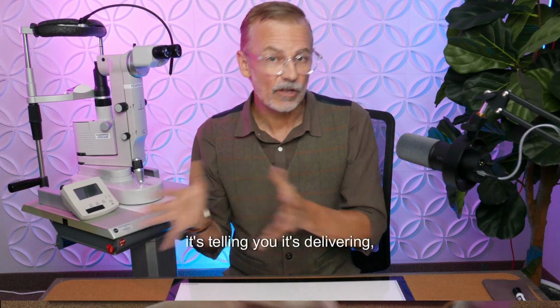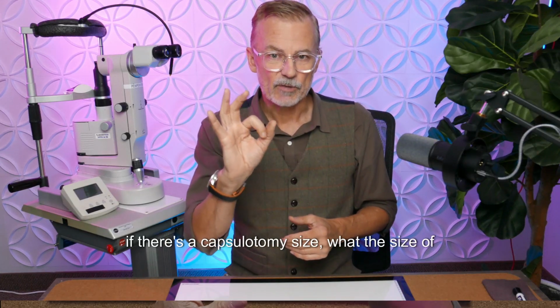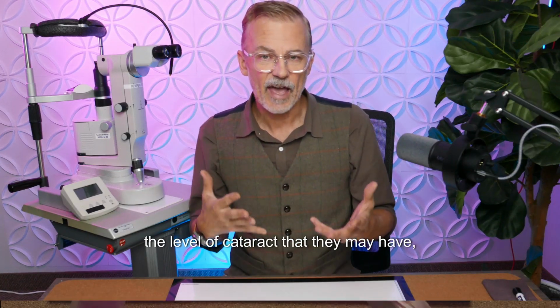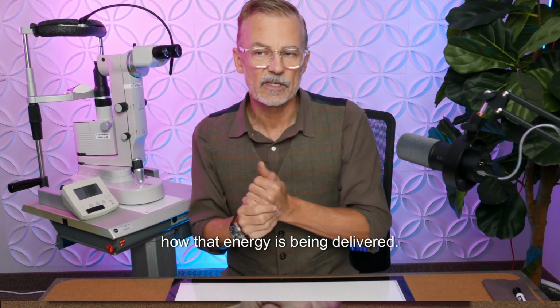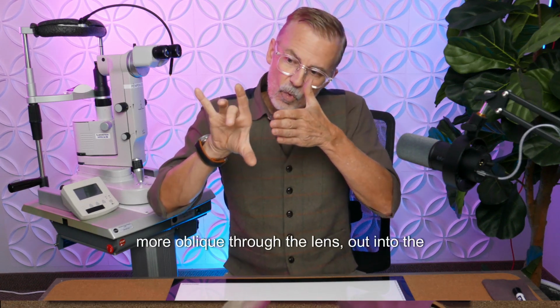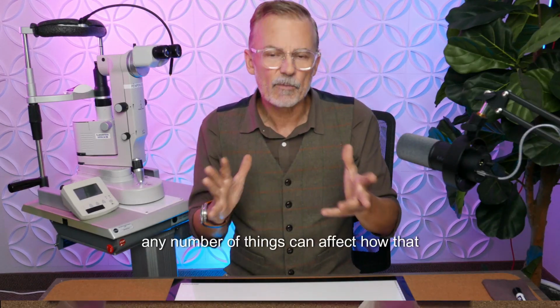That's what it's telling you it's delivering, but what you're actually delivering has a lot of variability. It depends on how far back you're working, how big or small the pupil is, the capsulotomy size, or if there's an implant lens, the level of cataract they may have, any astigmatism or optical distortion or radial keratotomy. Anything in the optics of the eye can affect how that energy is delivered, especially as you go more oblique through the lens out into the periphery.